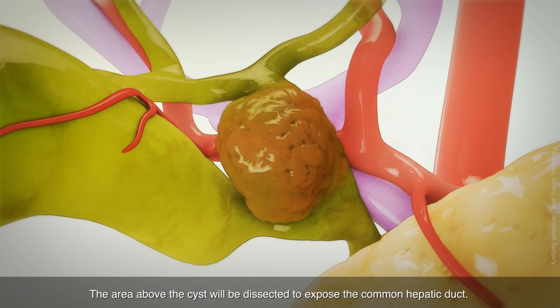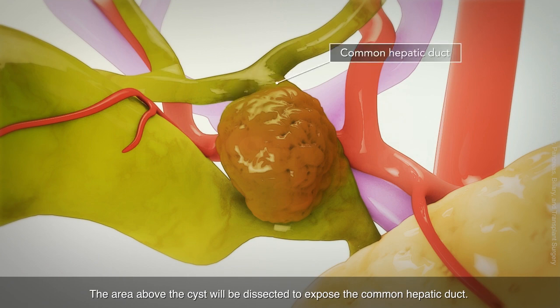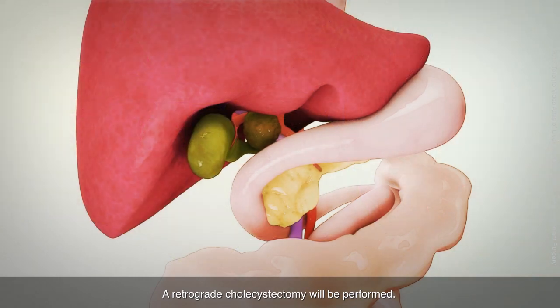The area above the cyst will be dissected to expose the common hepatic duct. A retrograde cholecystectomy will be performed.